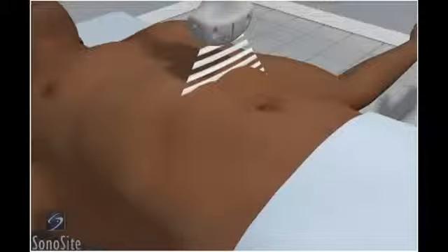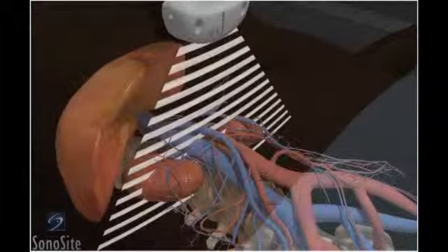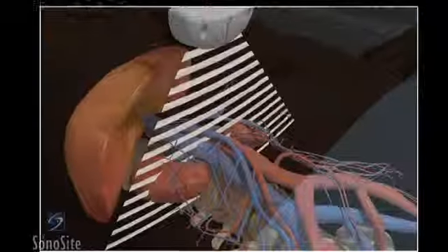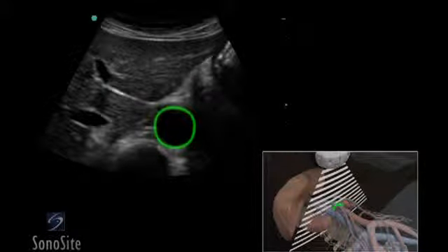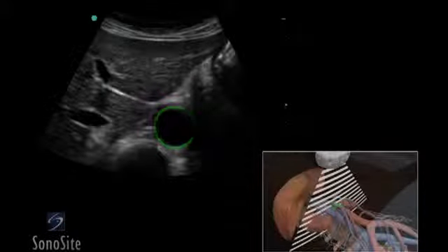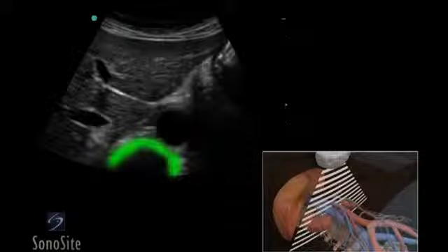The examination begins with the transducer placed transversely in the epigastric midline with the marker directed to the patient's right. The aorta is seen as a round, pulsatile structure anterior to the bright reflection of the vertebra.